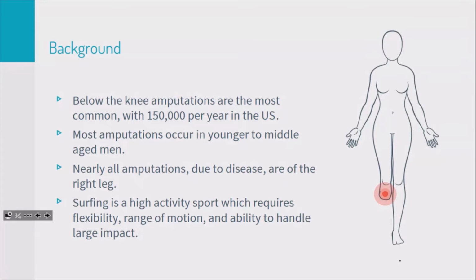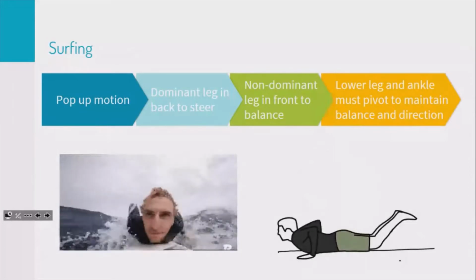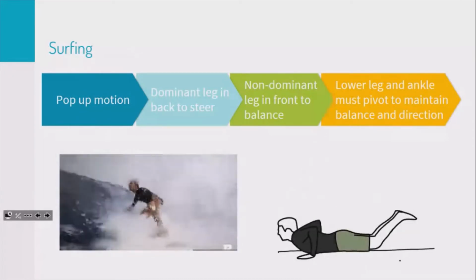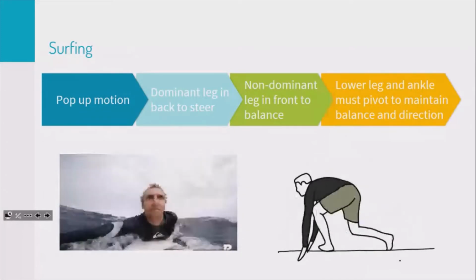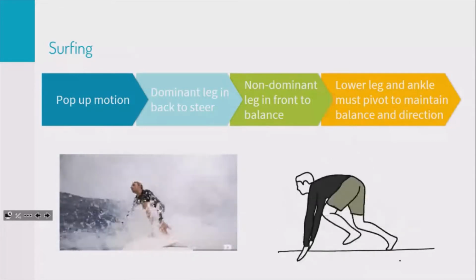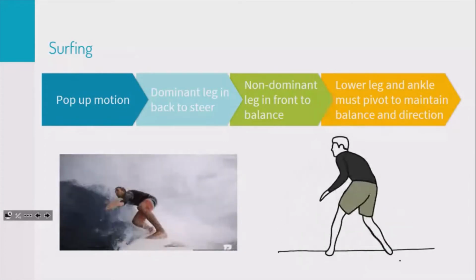Surfing is a high-activity sport which requires flexibility, range of motion, and the ability to handle high impacts. So our prosthetic can fix that issue. In terms of surfing, one of the important motions is the pop-up. When you're lying down on the board and you have to get up again, it's important to gain your balance with both the back leg and the front leg leaning forward. The dominant leg is usually put in the back and is used for steering, with the non-dominant leg in the front used for maintaining balance. In terms of the motion of the lower leg, your ankle is definitely used to pivot in order to maintain balance and also to steer with the fins of the board.